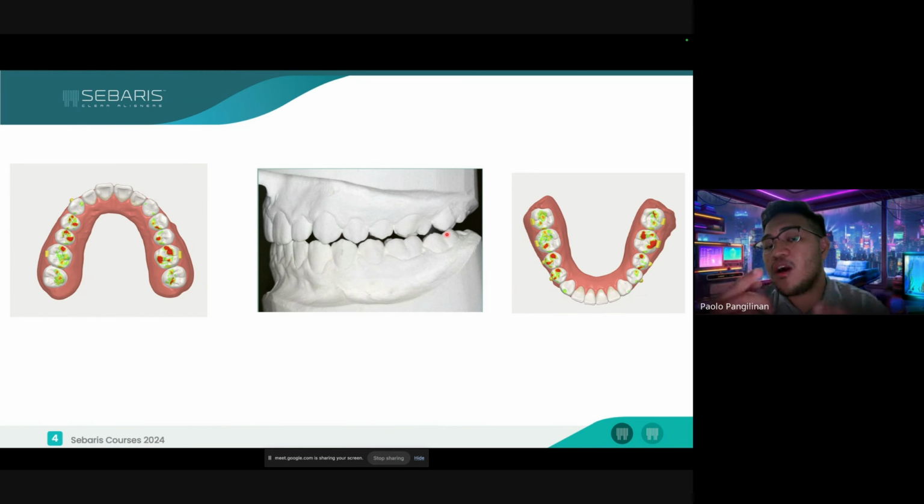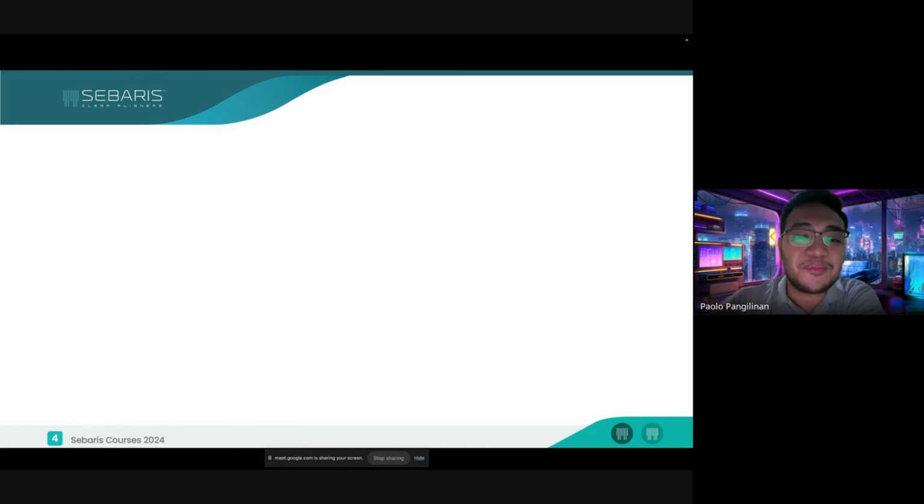Okay? And from the plastic perspective, the thickness of your aligner on your occlusal is around 0.75 or around 0.65. But as it goes to the anterior, it becomes 0.4. So just imagine a thin portion of your aligner. Once you remove both of those aligners, definitely your anteriors are going to contact first before your posterior. That is why, if you finish your case with contact on the anterior, most of the time you're going to see posterior open bites. Okay? Because of that predictability criteria.